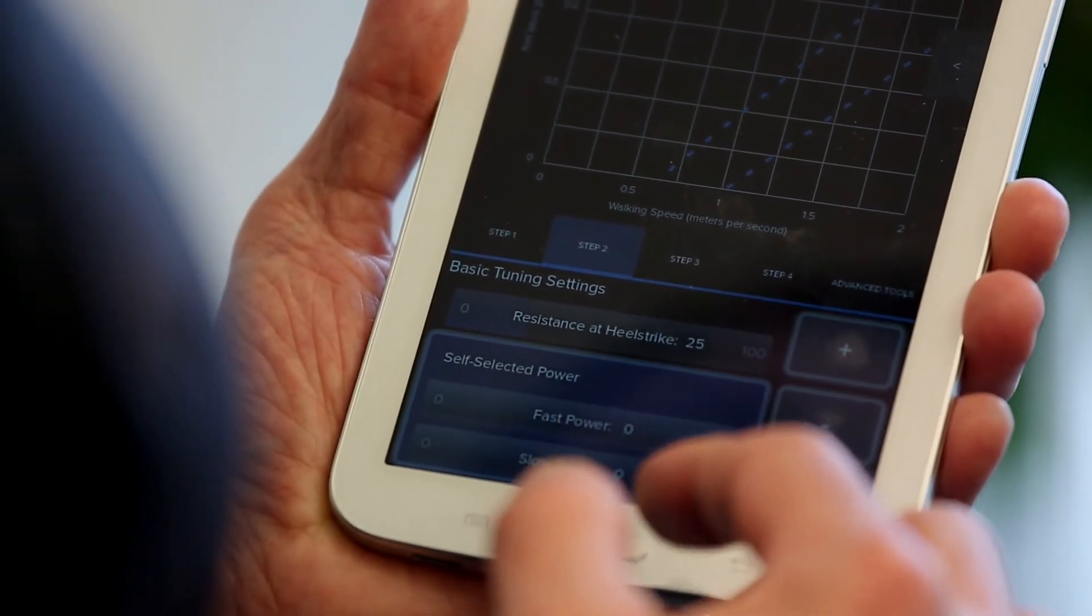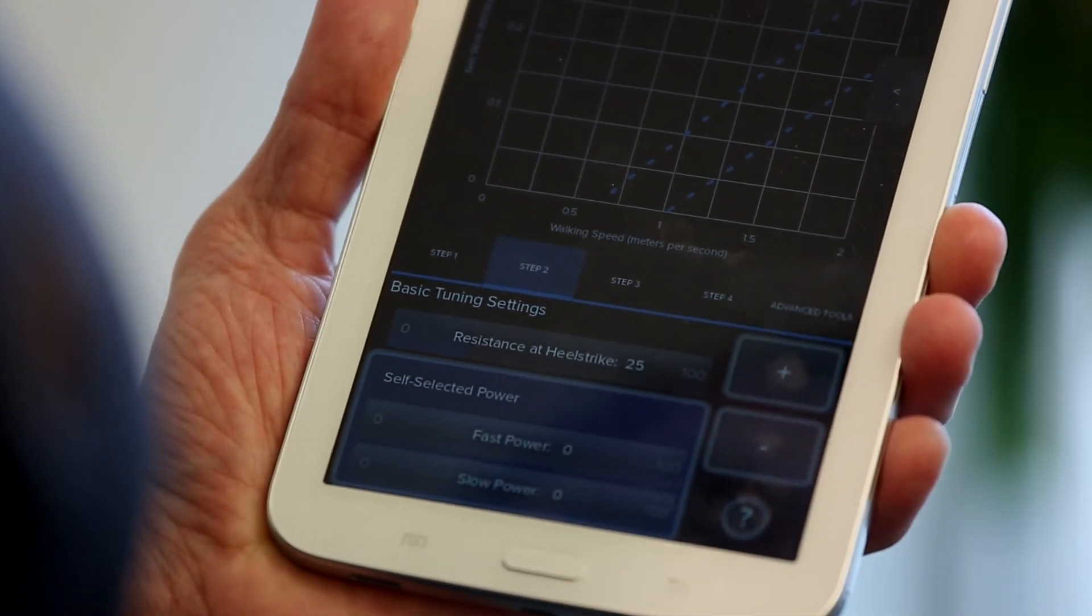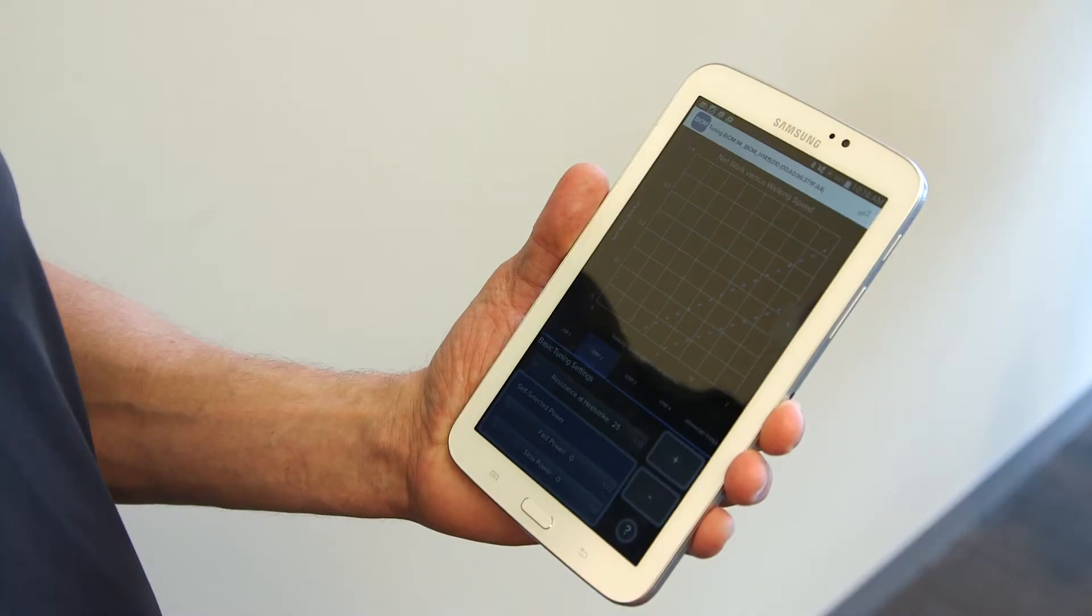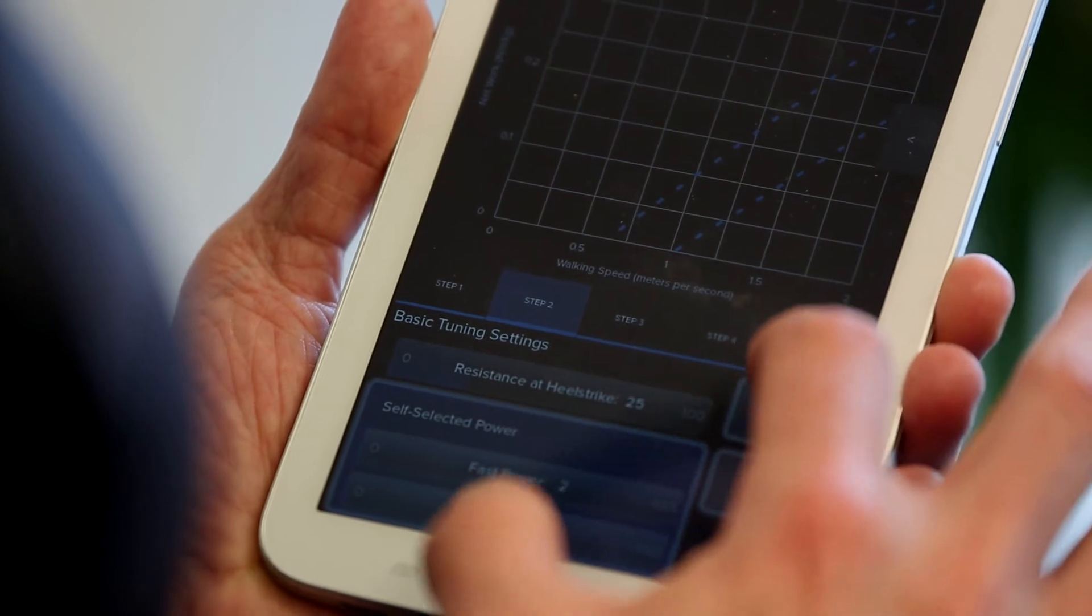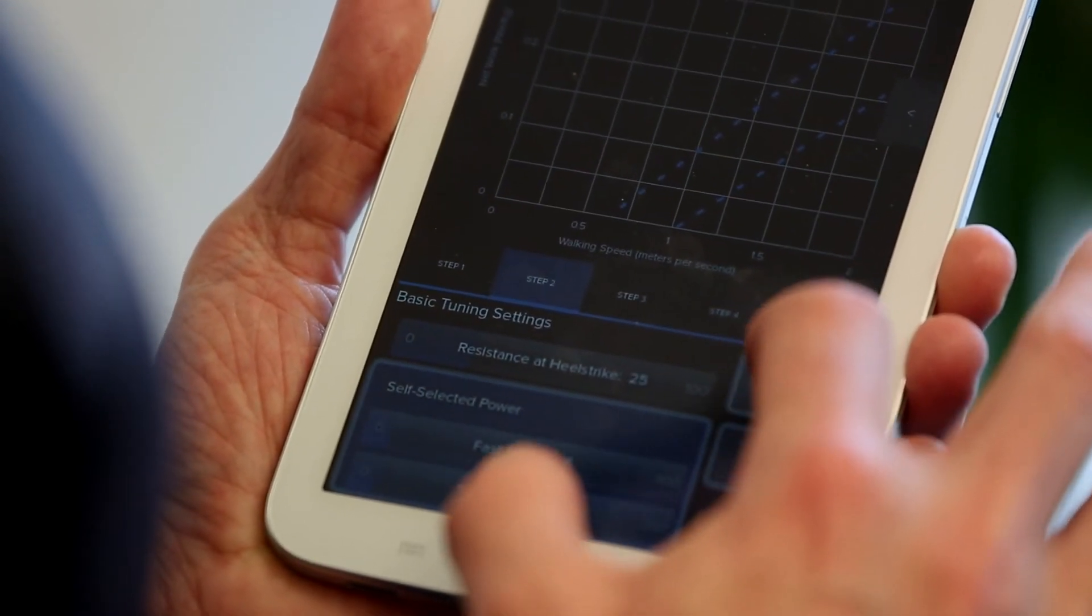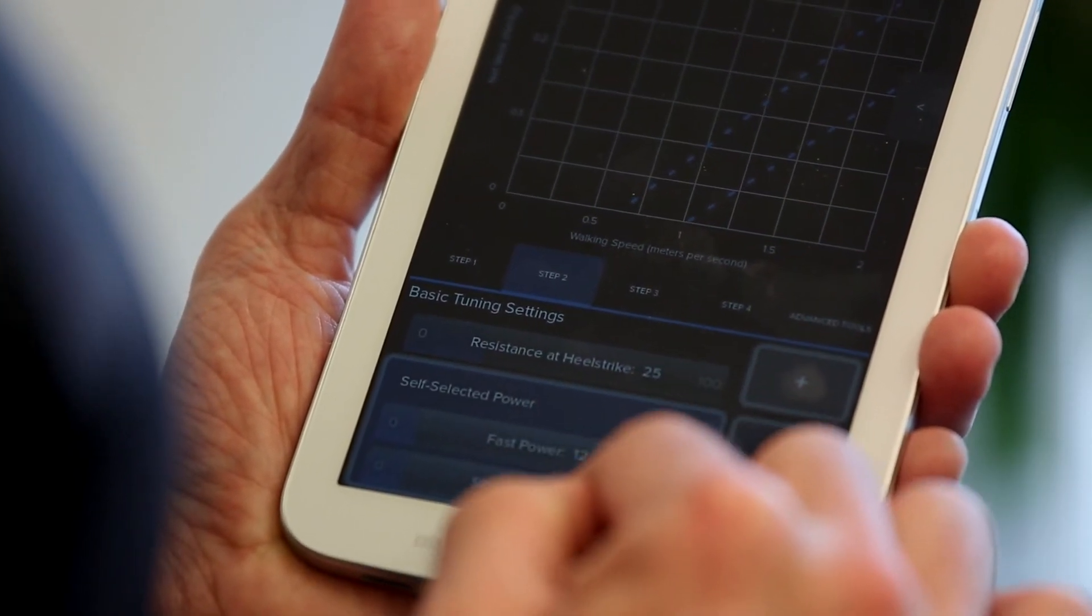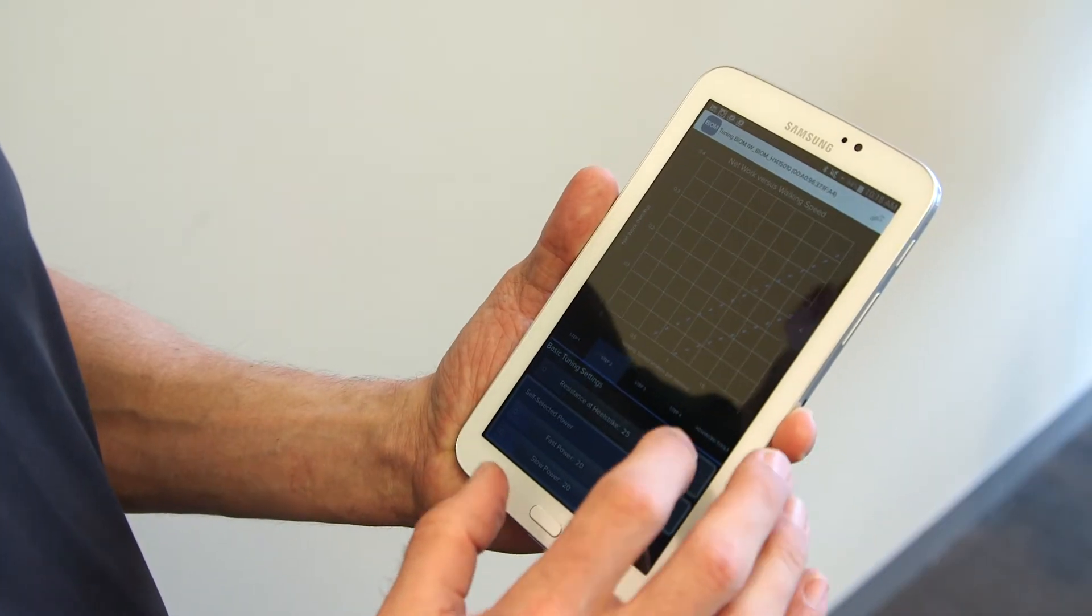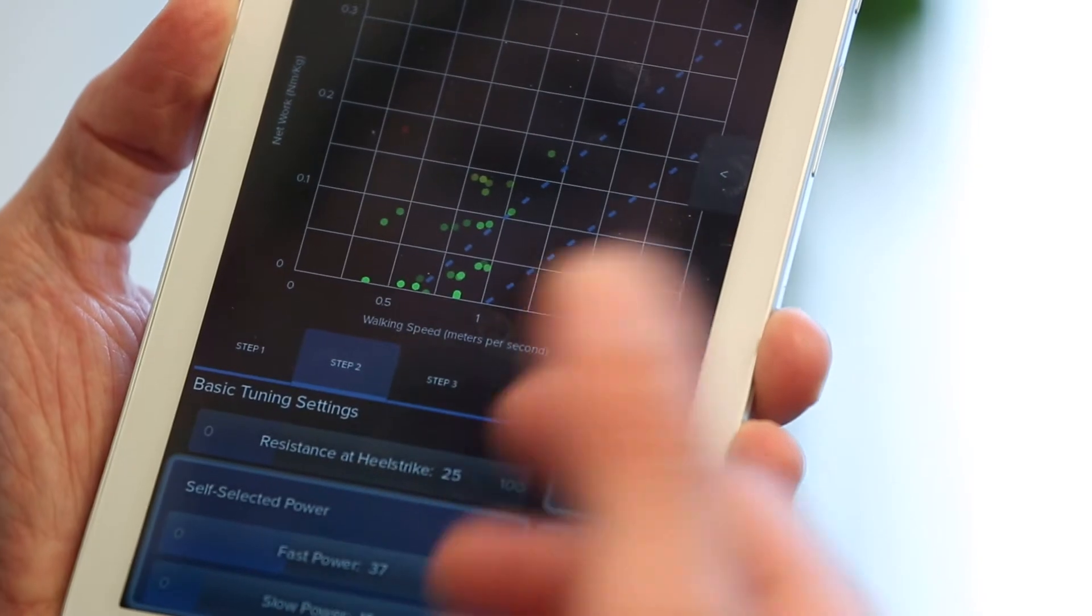You can see here I have three choices: self-selected power, fast power, and slow power. I'm going to begin with self-selected power. You can see this lights up the entire power box. At this point, I'm going to have the patient walk at their self-selected walking speed. I'm going to increase, just like I did at resistance at heel strike, 1% at a time, and we can see that the self-selected power will affect both fast power and slow power at an equal rate. I'm going to increase that until I start to see the patient exhibit steps on the network graph.